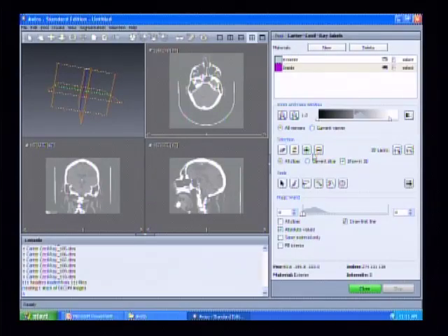These take the selection that you have highlighted in red and either add it to or subtract it from the material that you have highlighted at the top. This really comes into play if you were to separate the mandible and the cranium. You can select an area on your image and then select, say, crania or mandible and add or subtract it there.